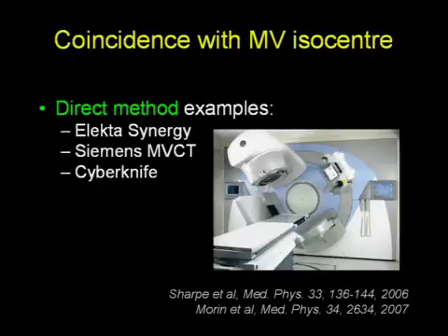So some vendors do recommend and do use the direct method in order to calibrate their isocenters, notably the Elekta Synergy system, the Siemens MVCT system, and the CyberKnife. And again, here are a few references to consider that describe in detail how to do it.